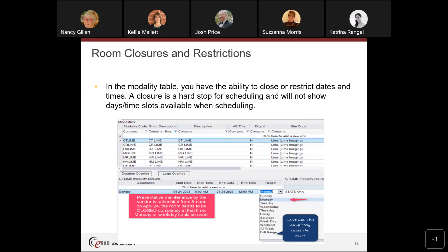In the modality table, you have the ability to close or restrict dates and times. A closure is a hard stop — nobody can schedule in it and it doesn't even appear in a search. A restriction is more of a warning that the room could be opened if needed, but is being held for certain procedures or certain doctors. For example, if an outside physician comes in to do a biopsy, you can hold a room for that doctor for a certain amount of time by entering a placeholder procedure.